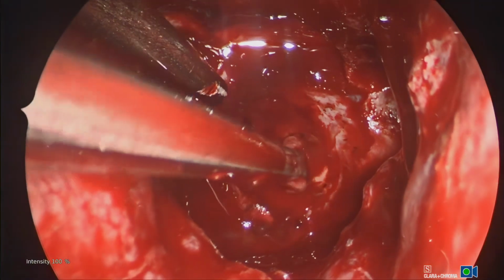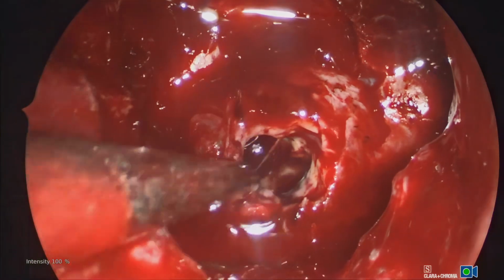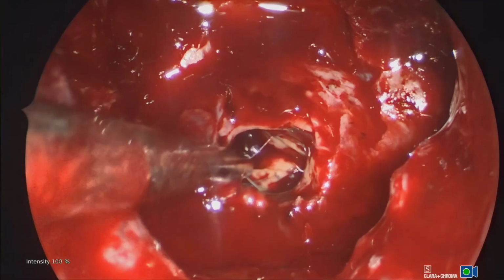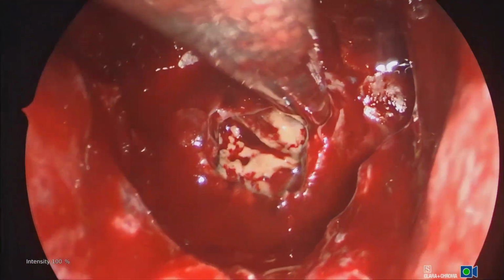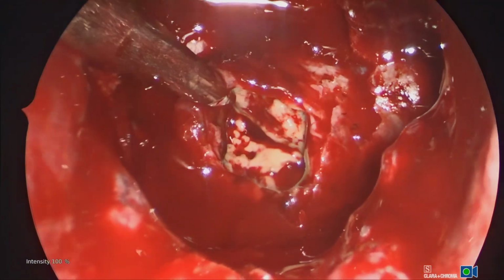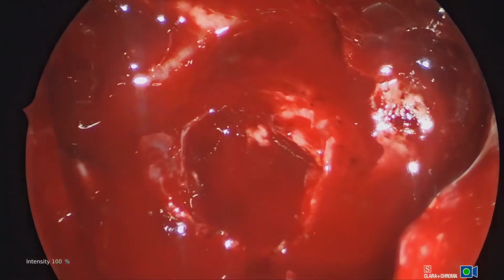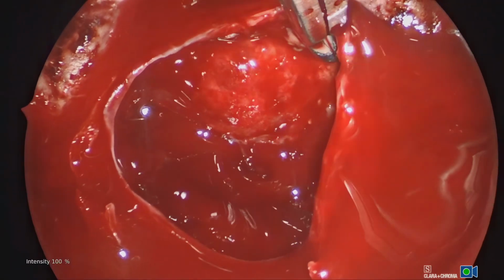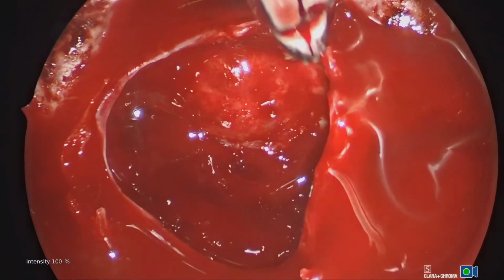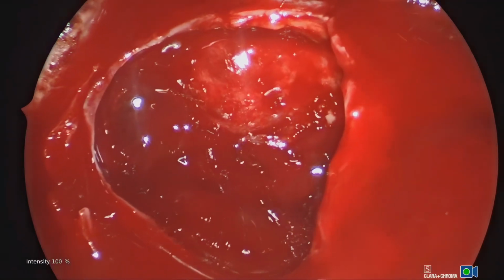Here we're beginning to open up the tumor and send some tissue for extemporaneous pathology to confirm that it is indeed a benign lesion. Gentle suctioning can remove the soft parts, and curetting is used to remove the remainder of the parts at the margins, inferior and superior aspect of the tumor. Here we can see the last little bits of tumor being removed. You can see the diaphragma sellae is hanging down and gently pulsing, indicating a complete tumor removal.